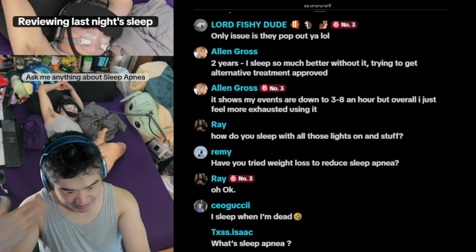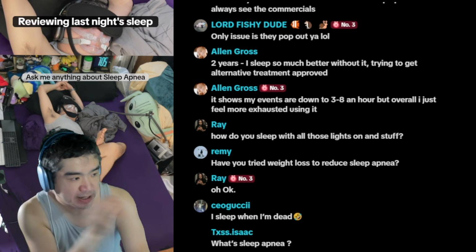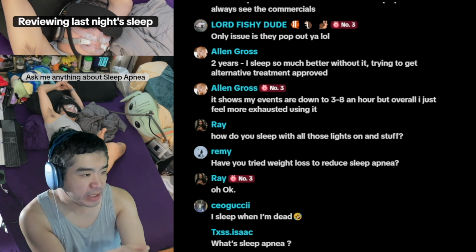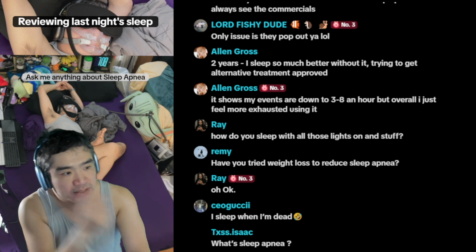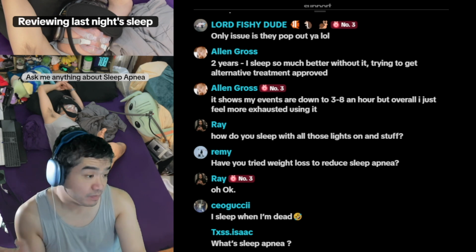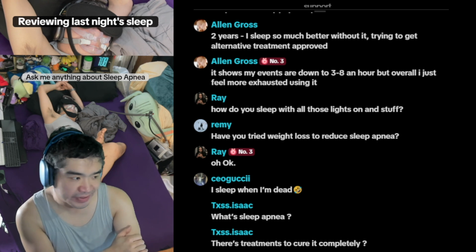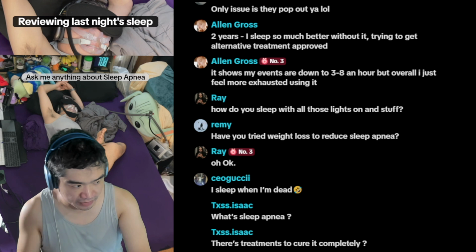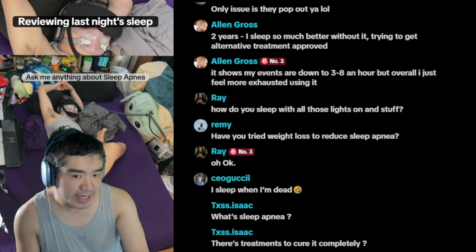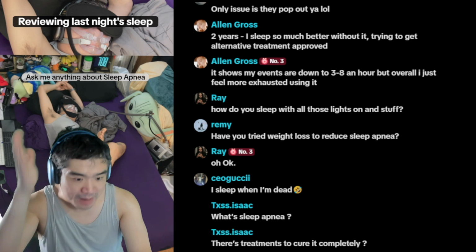So back to my spiel about my perspective 6 years into treatment, looking back at where I was 3 or 4 years ago. Yeah, I was in the same position, except for the sleeping without the mask thing. Now, people say this looks uncomfortable, and I am inclined to agree with them. I'm not saying this is definitely it for you, Alan, if you're still here, but there could still be comfort issues 2 or 3 years in. It took me 2 or 3 years to settle on this mask. So again, not saying you have to keep going with CPAP. You're already looking at alternatives. What's most important is to realize that the treatment is a tool, but putting it on doesn't promise you better sleep.